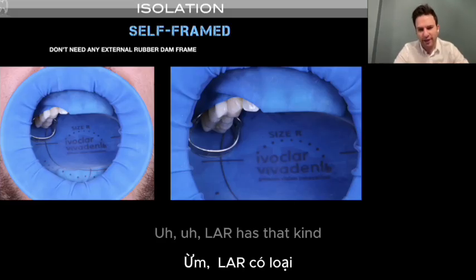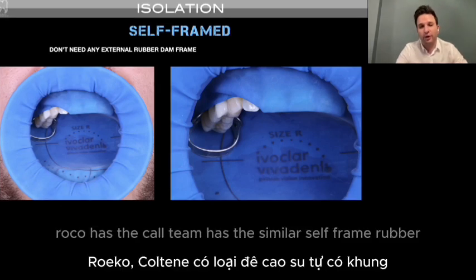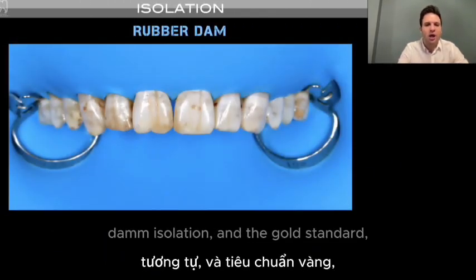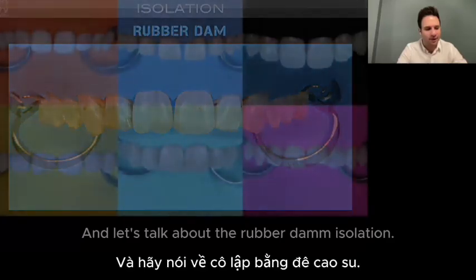Ivoclar has that kind of self-framed one, Cure has a similar one, and Roeko Coltene also has a similar self-framed rubber dam isolation. And the gold standard is the rubber dam. Let's talk about the rubber dam isolation.